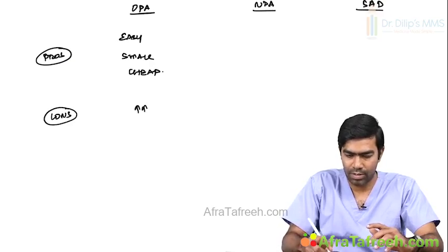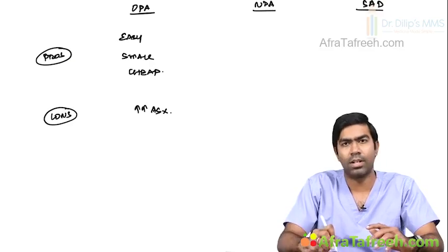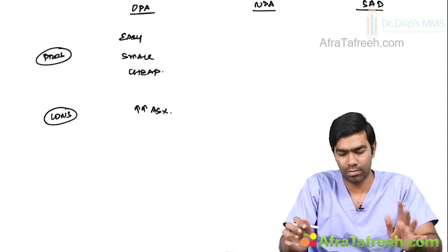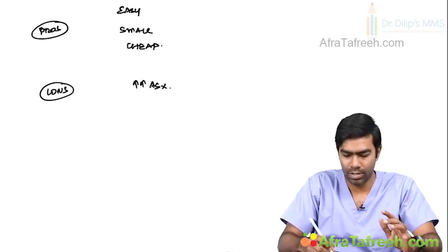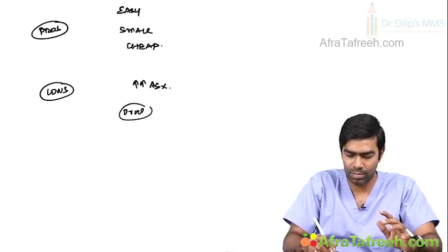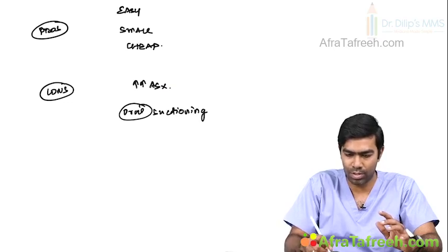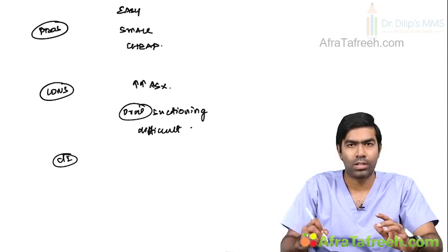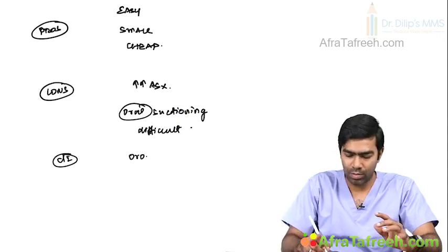Definitely a very high risk of aspiration. Clear? They do not provide any protection against aspiration. And suctioning is very difficult, especially oral suctioning, which becomes a hell of a job with an oropharyngeal airway in situ. Oral suctioning is extremely difficult. Clear? Contraindication: a patient who is having extensive oropharyngeal trauma.